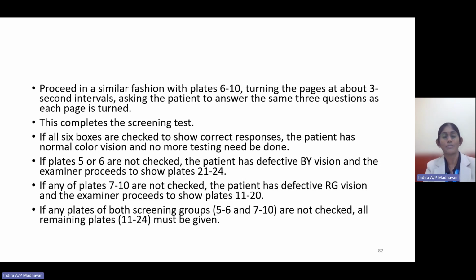When you flip the page, if the patient has no problem, no issue at all, you can just proceed quickly. If the patient is struggling, then you should know that this patient is having some color vision defect. So you have to be patient, but at the same time, they cannot drag on for 5 to 10 minutes just to answer one plate, obviously.